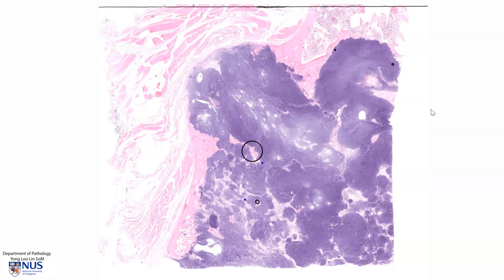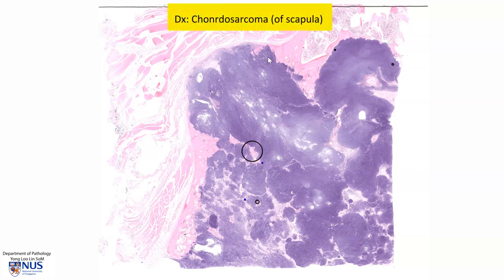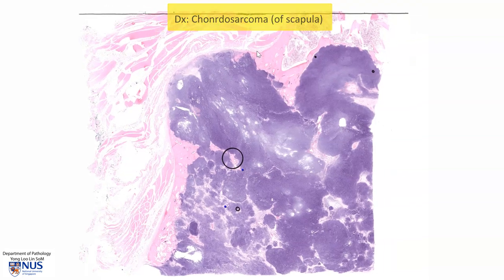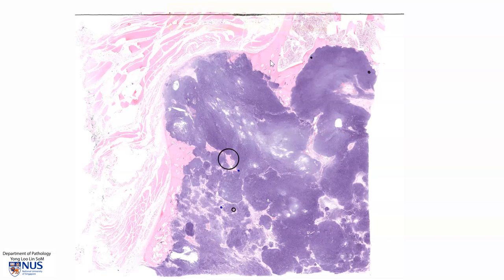Hello, this is a virtual microscopy slide showing a case of chondrosarcoma involving the scapula. Let's orientate ourselves at low magnification first. This is the outline of the bone, the scapula, and we're looking at this pink area which is the bony cortex.